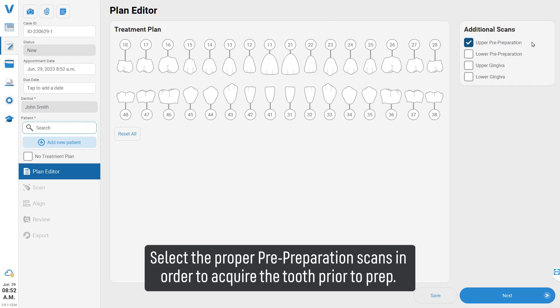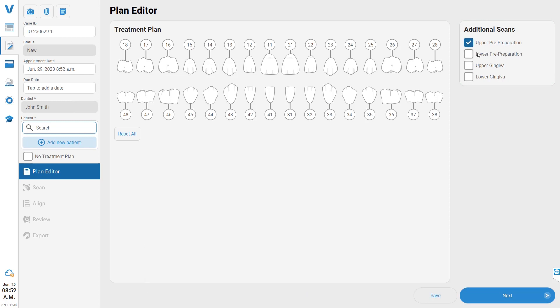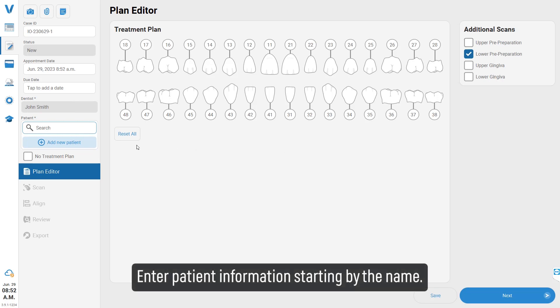Enter patient information, starting with the name.